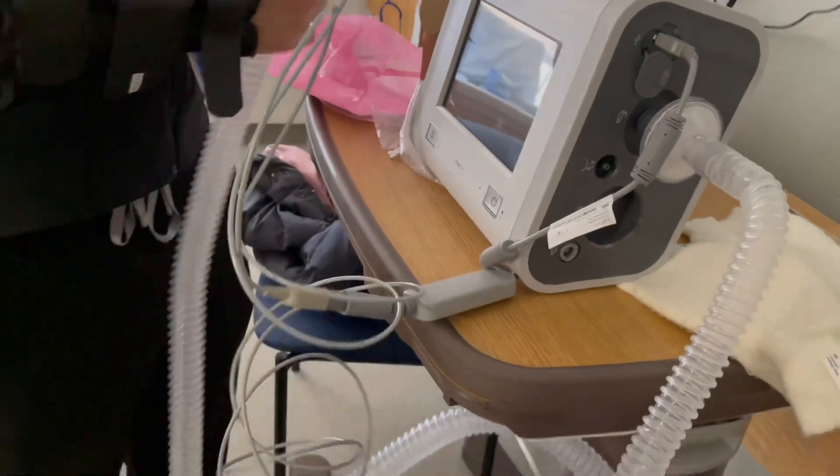I'm going to turn to the patient, but I think you need an adapter or the corrugated tubing, so I'm going to grab that.